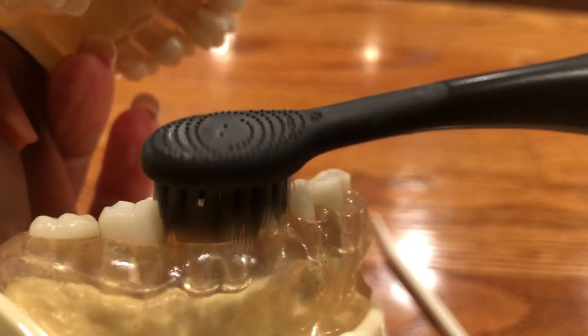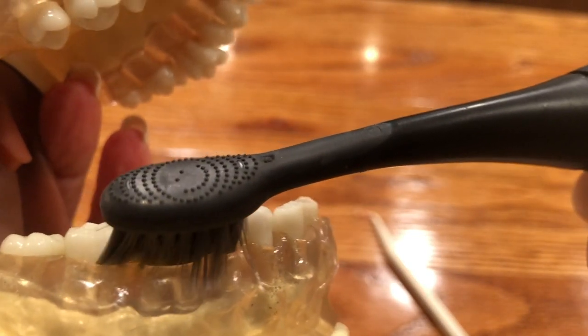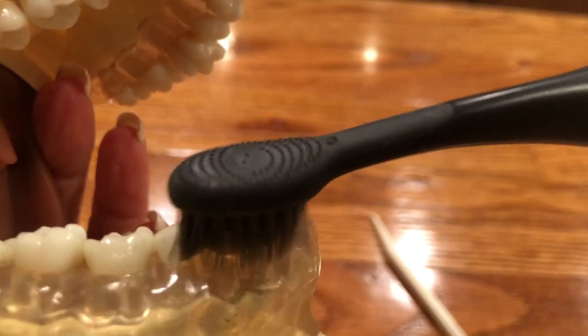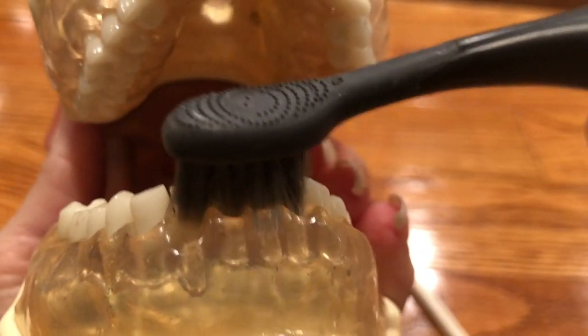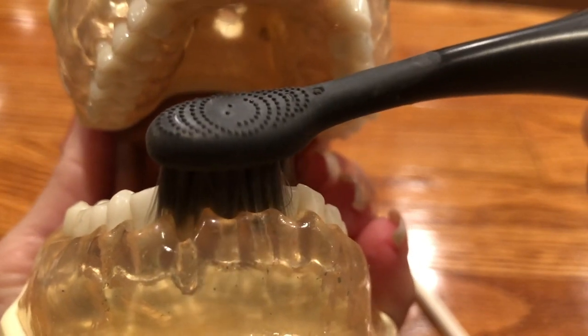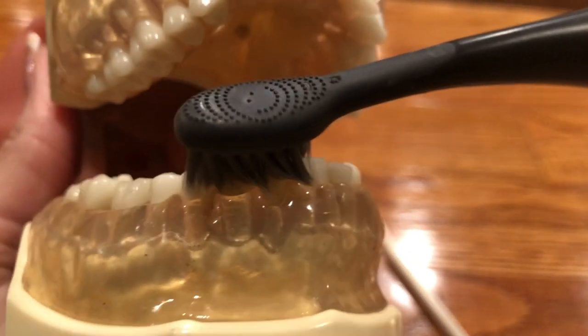Let's see if I can do it this way. See how far down it gets below the gum line? All you have to do is hold it, and it will angle and do the motion for you. See how far it gets down below. So that's about 3 millimeters, but you have to be angling your toothbrush.